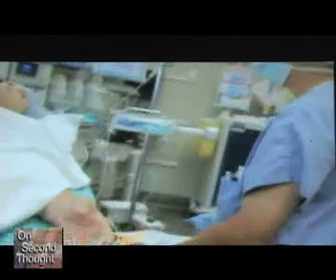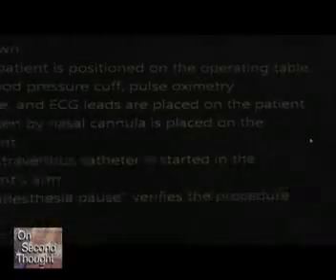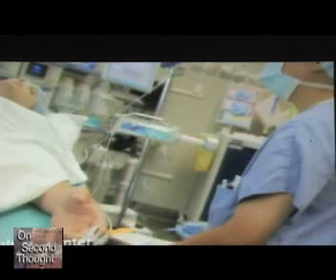Okay, at this point, that's all going to be skipped, and we're now going to see the patient on the procedure table. So first I'll stop. The pulse oximeter went by quickly, but it's just a little probe on the finger. That little white wire that you can see running here, thank you. That's the pulse oximeter on the finger. And here's the white wire running back to the monitors.